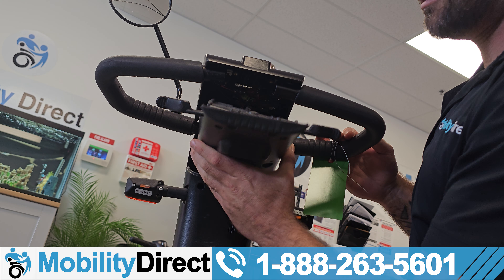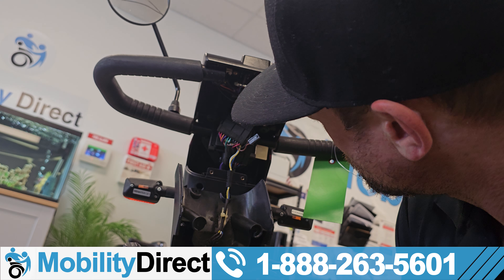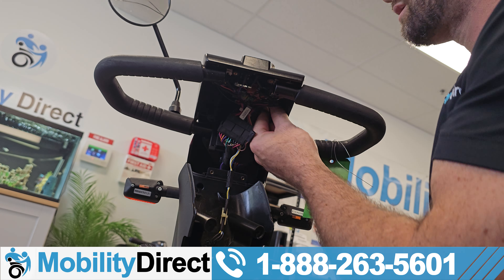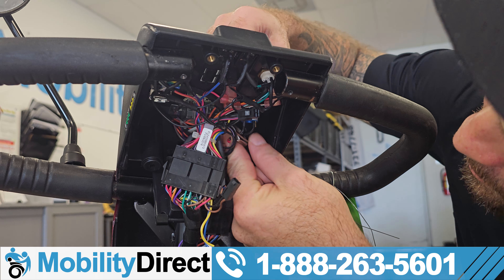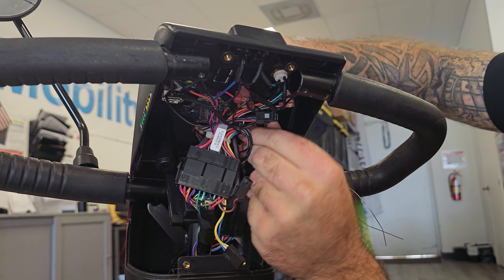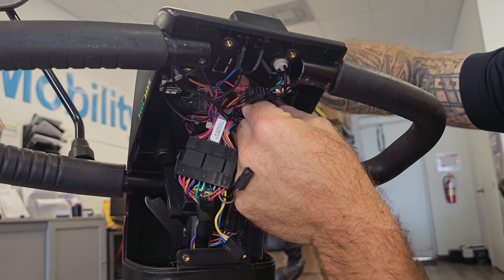I got the last screw out, and this is what you can expect to see on the inside of your scooter. That's the main harness — that big connection with a whole bunch of colored wires coming out of it. What you're going to want to look for is back behind that, and you'll find this little nut on the back side of the ignition cylinder.